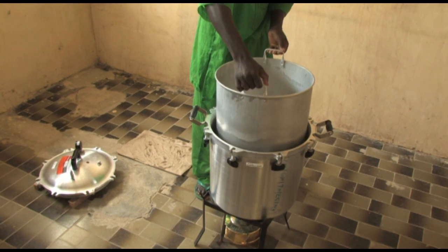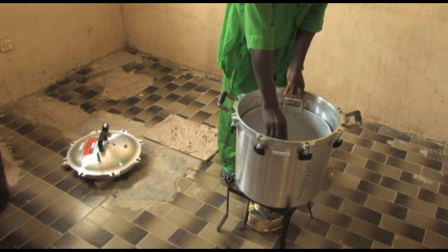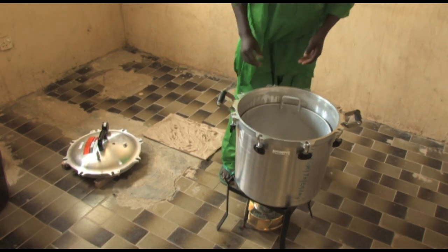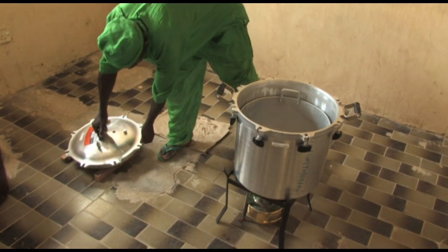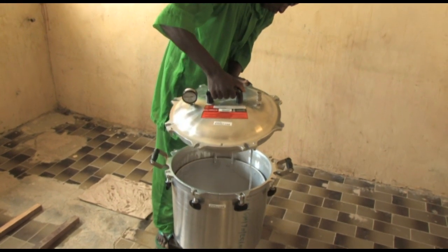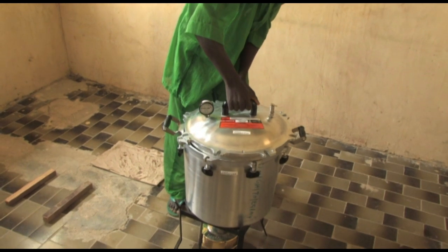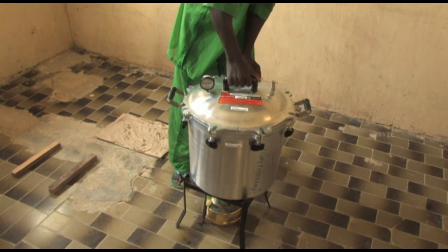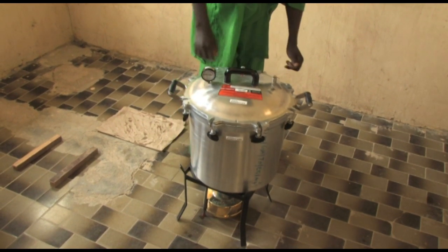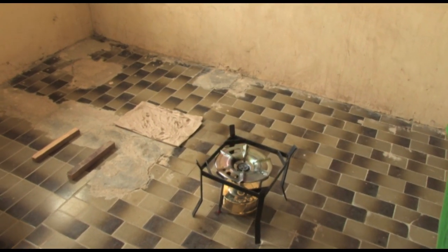Once the sterilizer is clean and has dried, place the lid on the unit. For storage purposes, it is only necessary to slightly tighten the wing nuts — just enough to hold the cover on the base. During storage, it is recommended that the control valve is left in a vertical position, open, to allow air to circulate in the base.